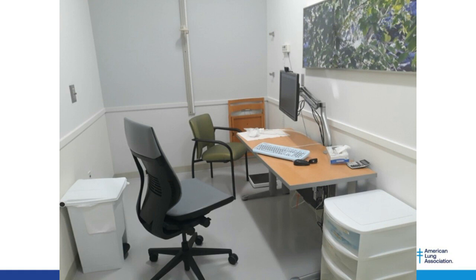All of the disposables are inside Rubbermaid plastic bins so that the patient can't cough on something that you're going to use on the next patient. The computers and all the different kinds of things that don't need to be sitting on the table are under the table, right? There's Kleenexes available.